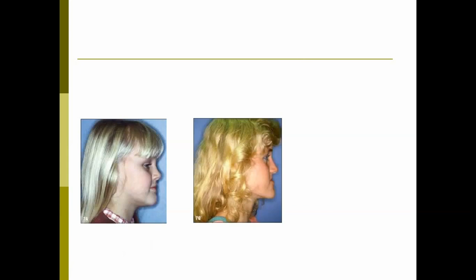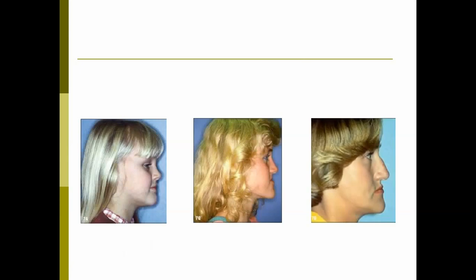Sometimes you see a girl growing very normally and maybe she had some skeletal problem. You corrected the jaw bone. However, with growth, you see that the mandible still continued to grow in an abnormal direction and continued growing forward. And the patient turns out to become a class 3 following the treatment is over. So the lesson we need to learn is sometimes if you are suspecting any skeletal problem in any of the patient, you need to give a myofunctional appliance as your retention appliance to retain the results you have achieved.